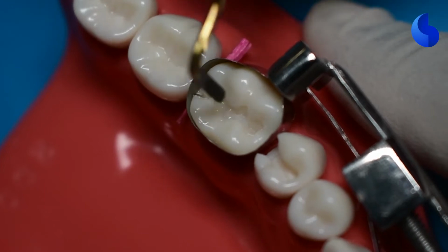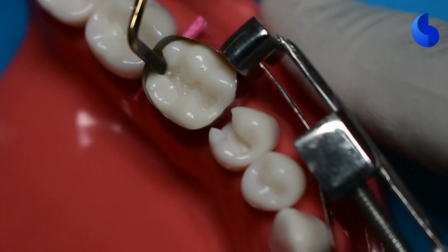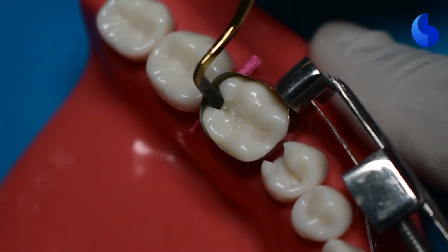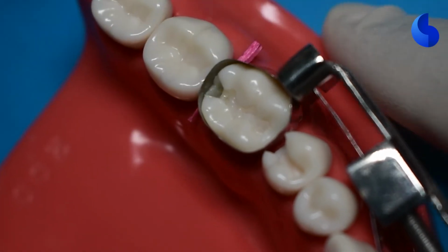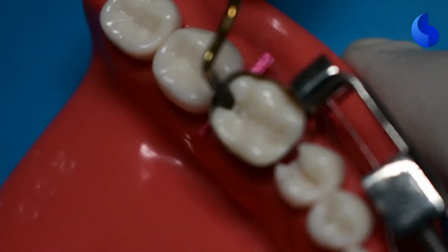So now that we're done with our first layer of composite, we can go ahead and start adding our second layer. And this time we're going to be adding it into the proximal box. When you're condensing composite or amalgam into the proximal box, make sure that you're condensing it all the way so that the material goes up to the cervical area, covering the gingival floor, and you don't have any voids.